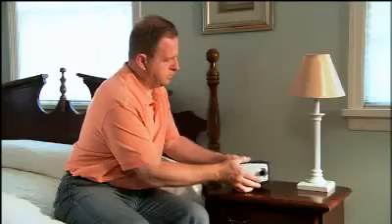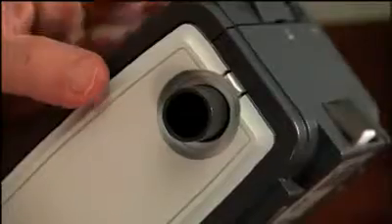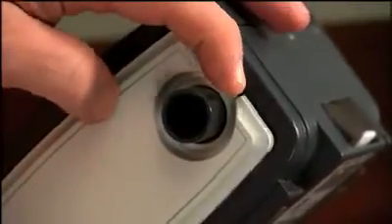Since breathing forced air can dry out your nose and mouth, your doctor may prescribe a humidifier to add moisture to the air you breathe. To connect a humidifier to a System One device, remove the side cover. Press on the tab behind the air outlet port and gently pull the cover off.